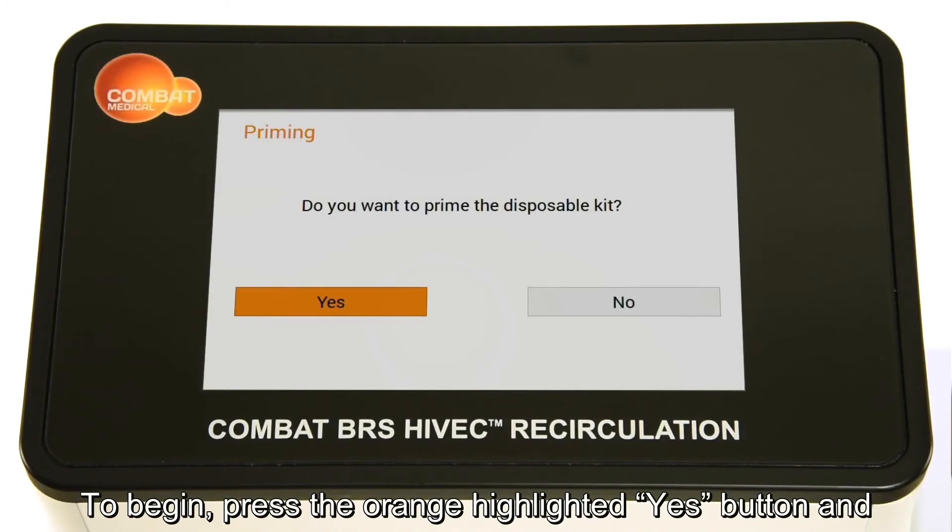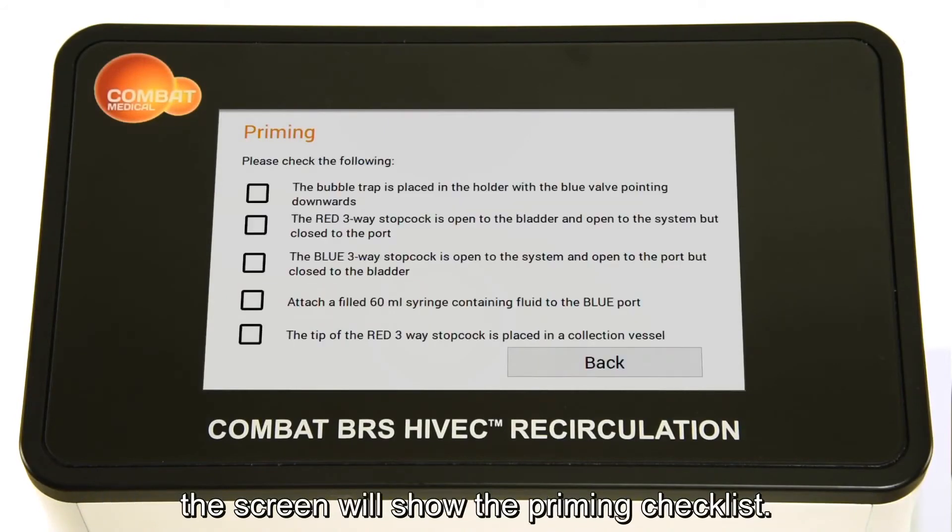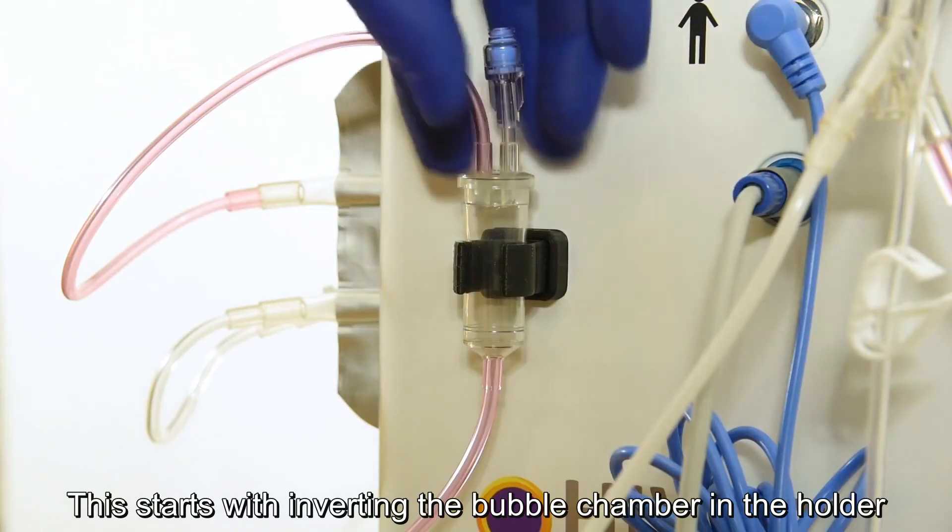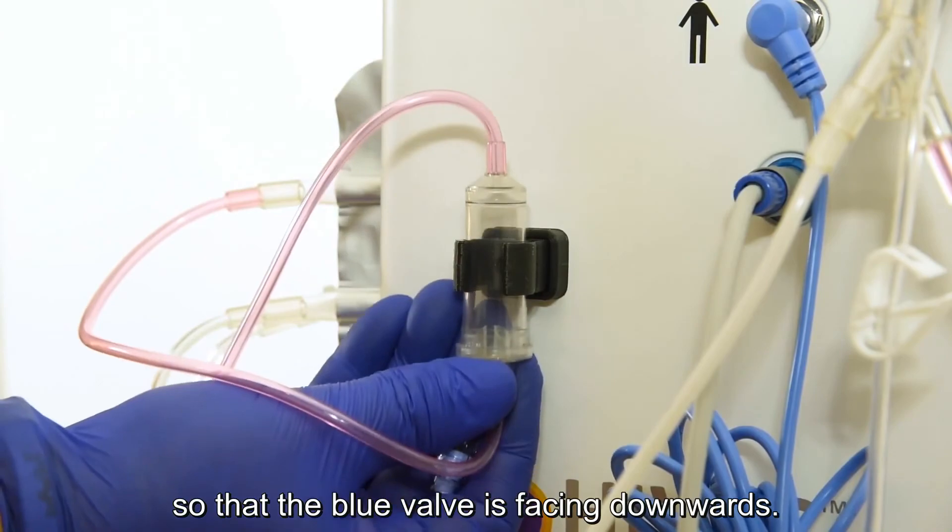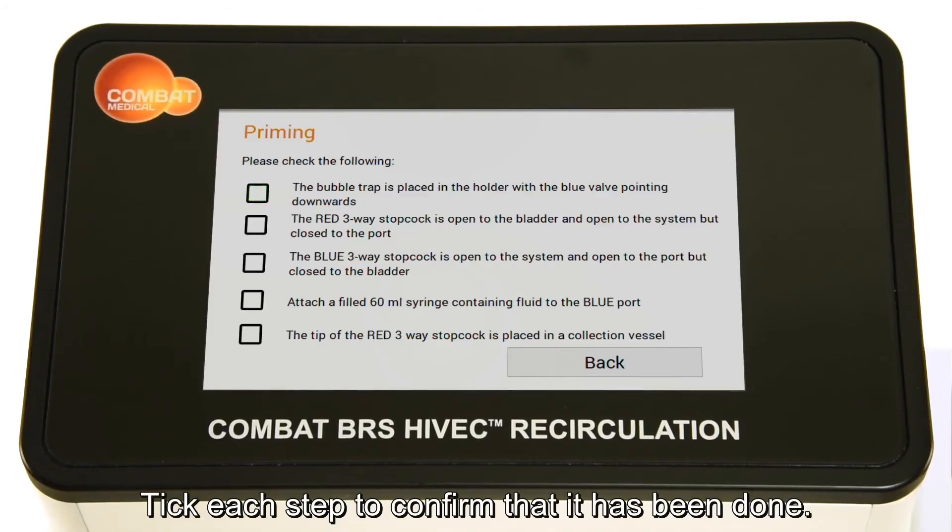To begin, press the orange highlighted Yes button and the screen will show the priming checklist. This starts with inverting the bubble chamber in the holder so that the blue valve is facing downwards. Tick each step to confirm that it has been done.